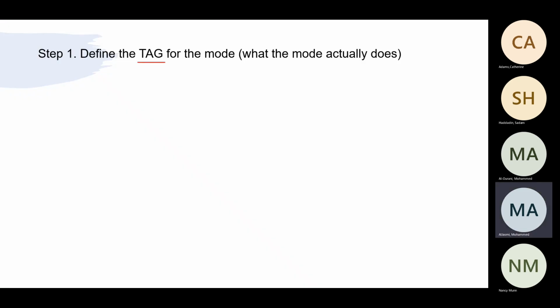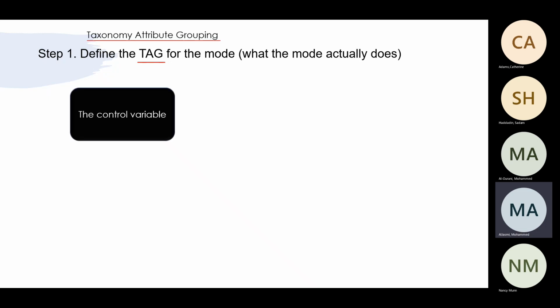All right. And then we talked about why we should even know this, why we should know the variables and everything. The machine says volume control, the machine says pressure control. And all of you who work with me, I showed you that the machine says volume control, however the machine is actually doing pressure control. And sometimes it says pressure control, and the machine does both the pressure and the volume at the same time.